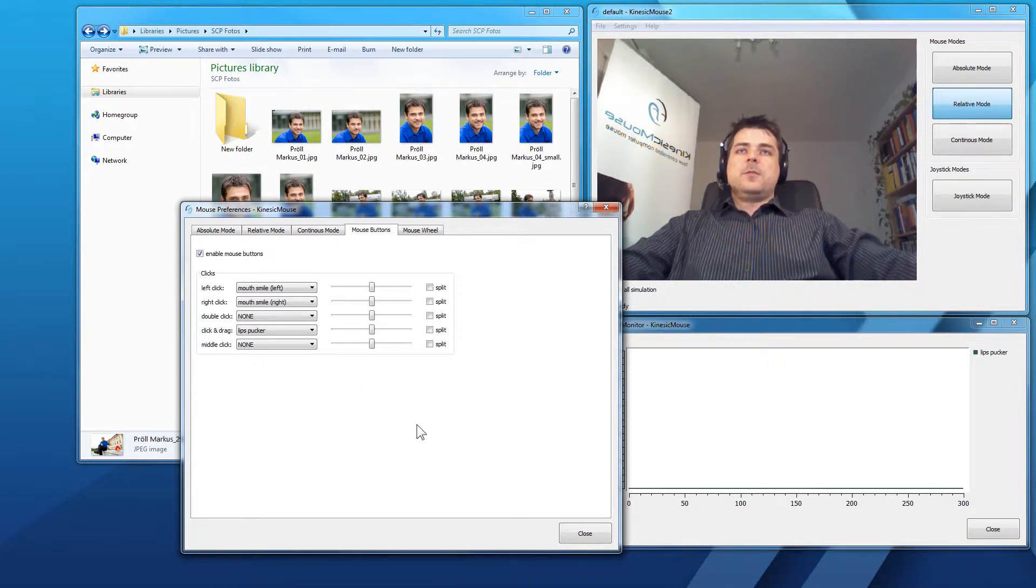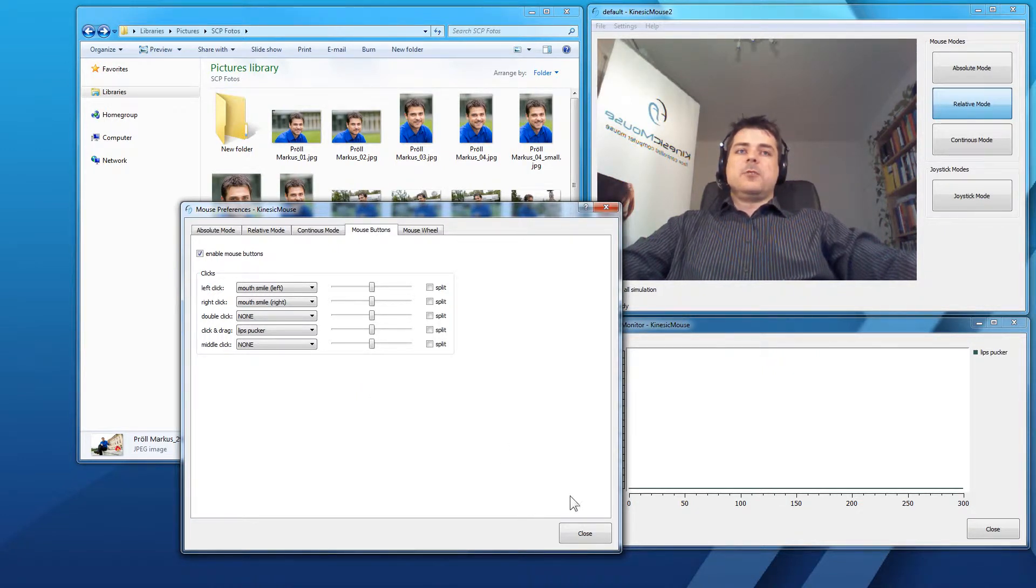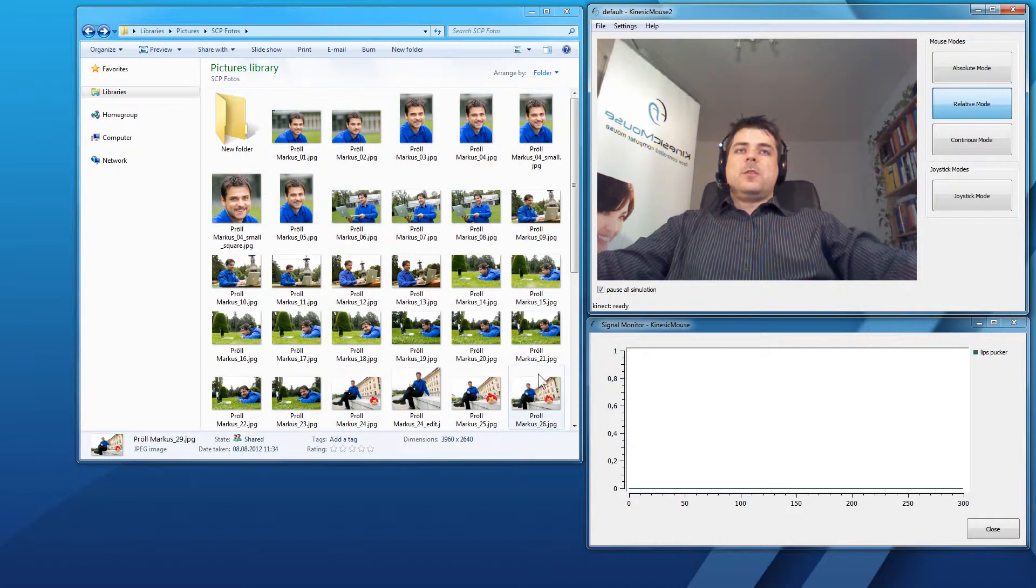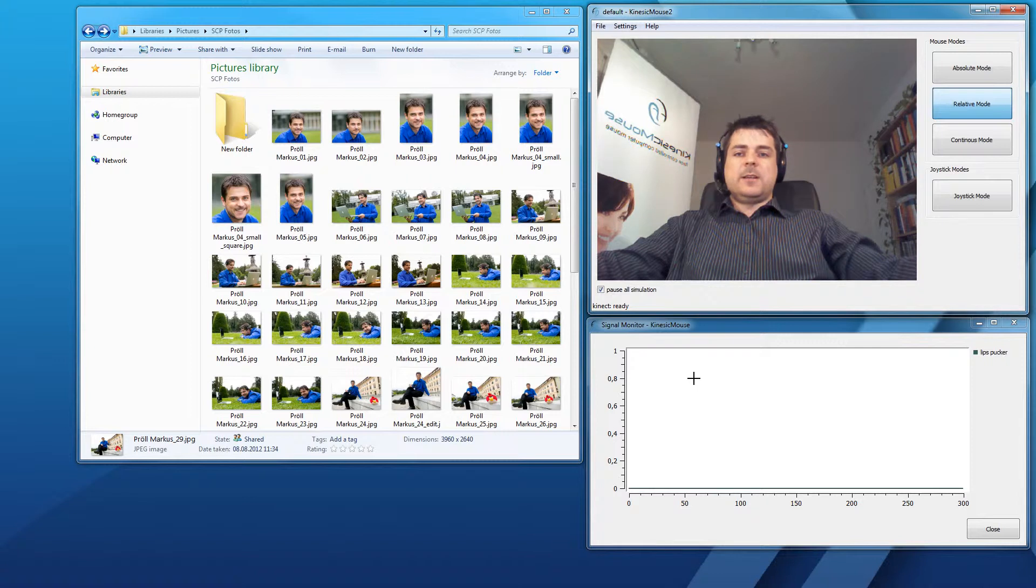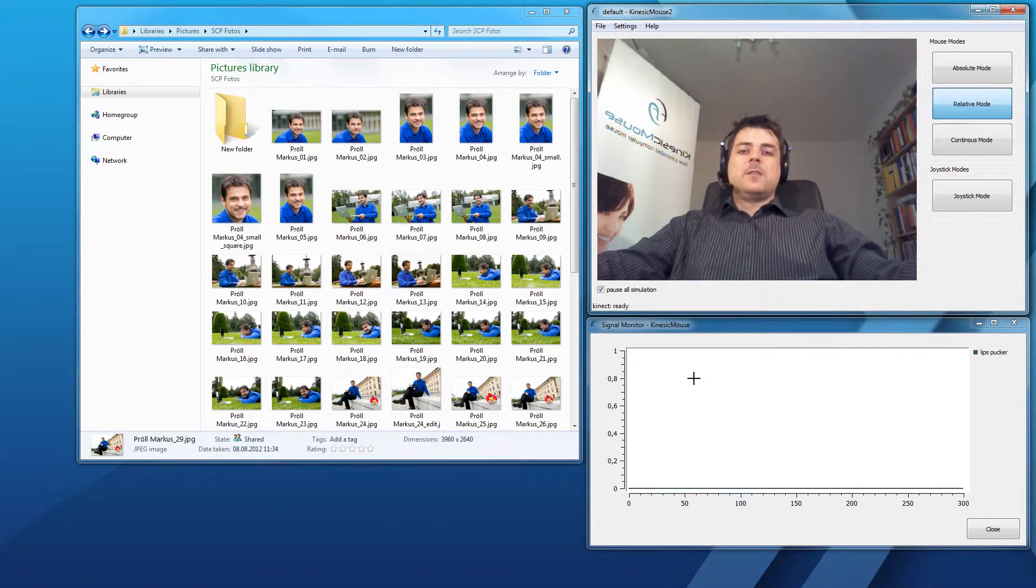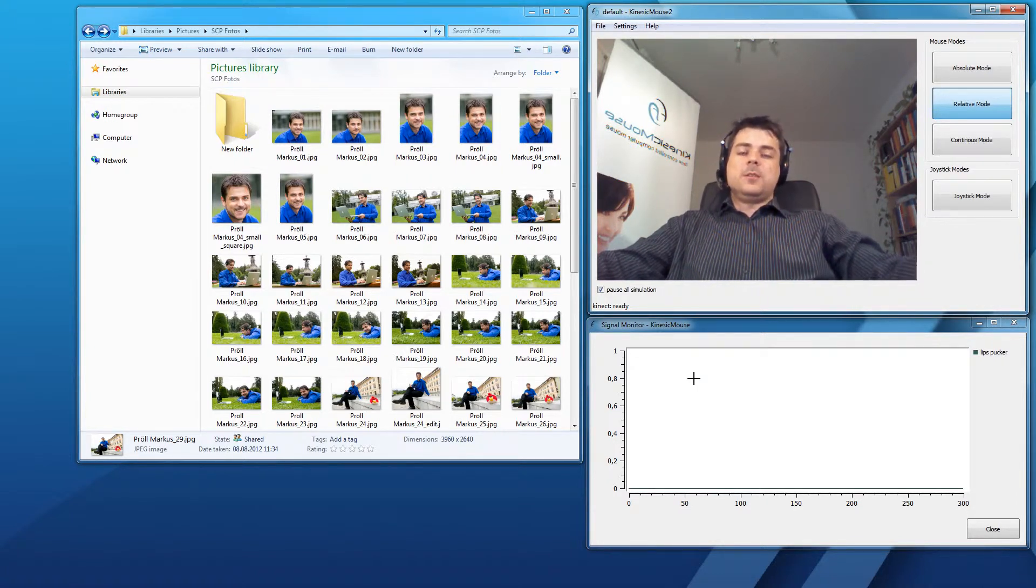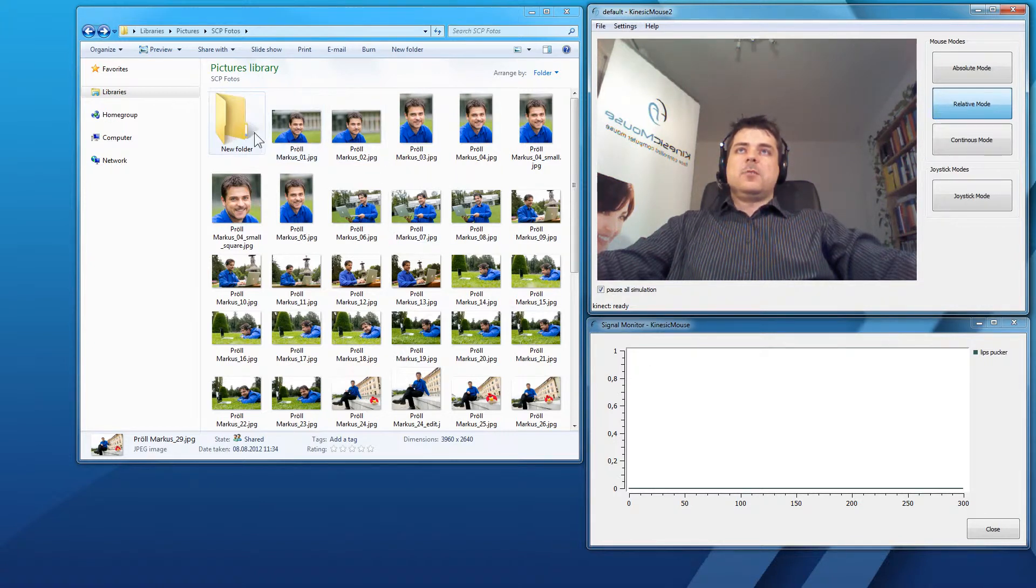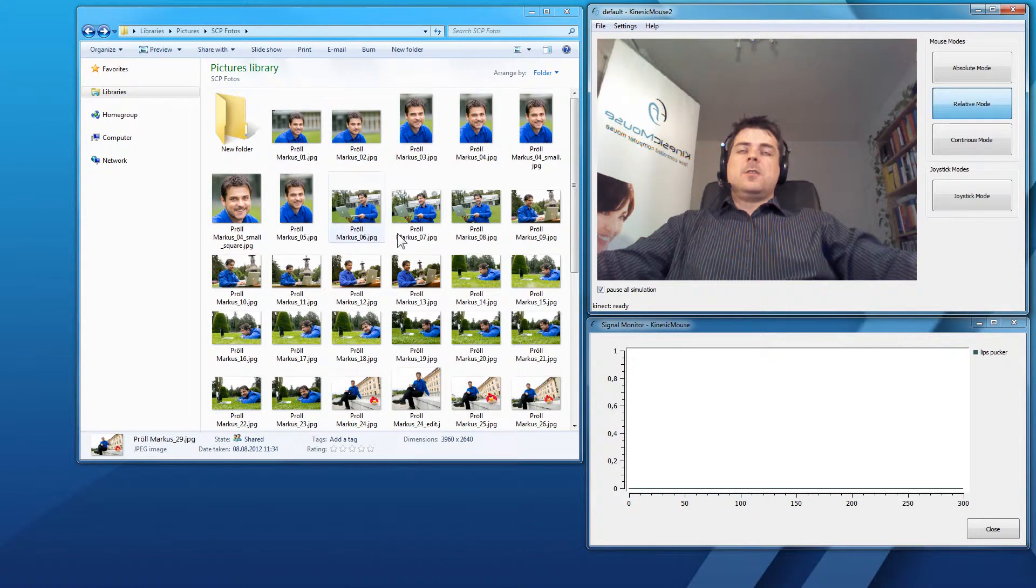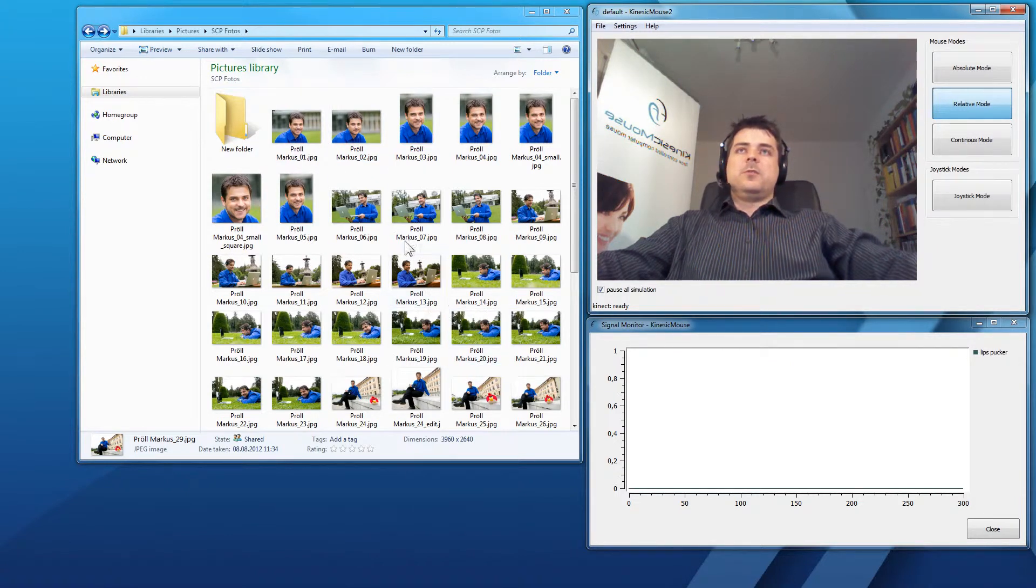That's all we have to do for performing a click and drag. The first method works when I'm performing the facial expression that I have assigned to the click and drag. I have to hold it to actually hold down the mouse button. I will show you this in this example where I click and drag one of the pictures to this new folder.